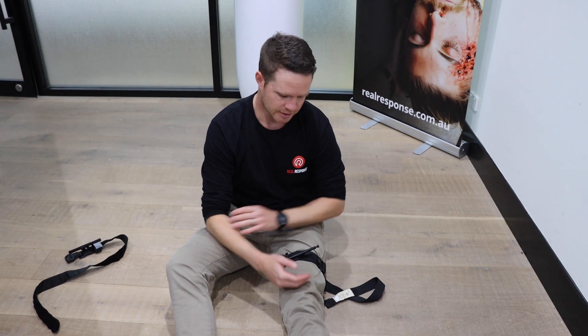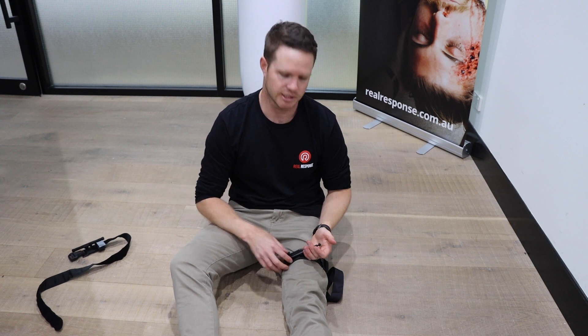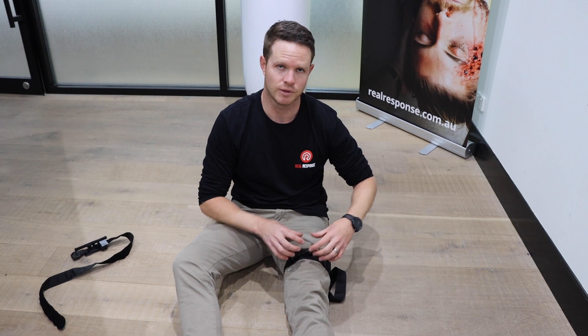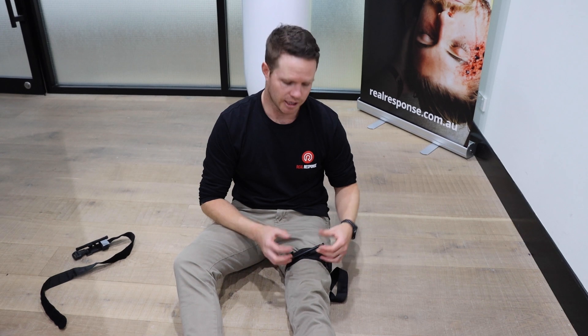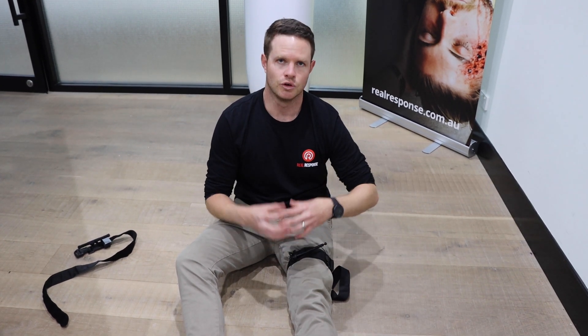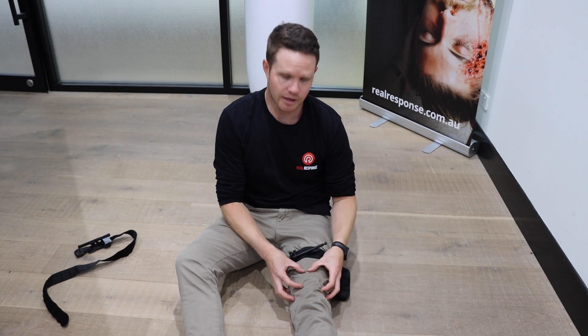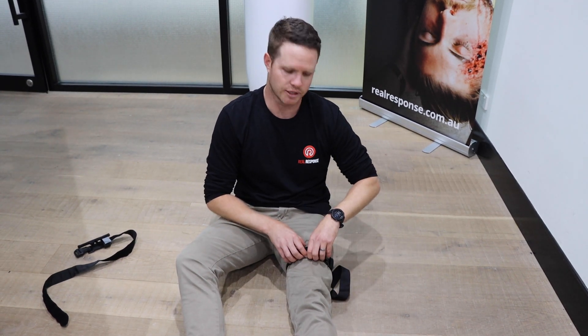The same principles apply: every time we move our patient and every time we do a reassessment, we come back and recheck those interventions to make sure they have not failed and are still working effectively. Once your tourniquets are on and time permits, we're going to start looking at packing and wrapping that wound - making sure clots form in that wound so that when they get to surgery, they can potentially loosen that tourniquet and proceed with definitive care.